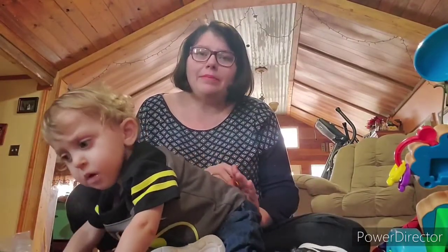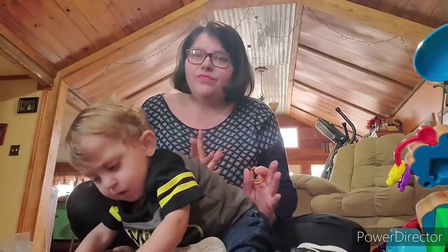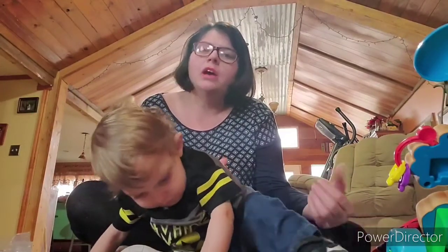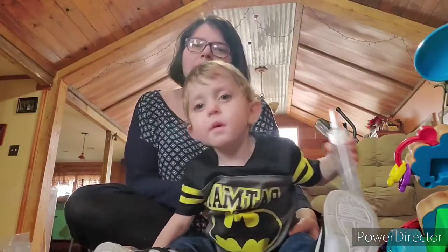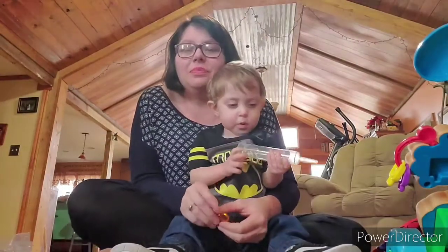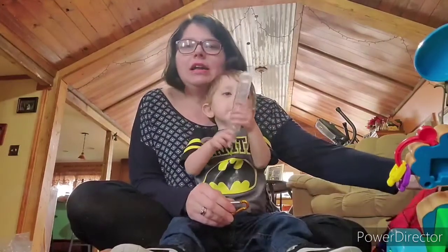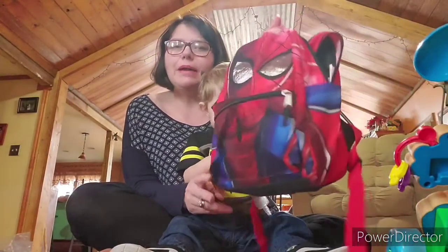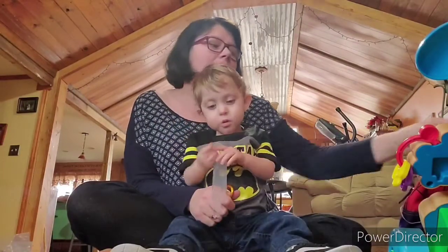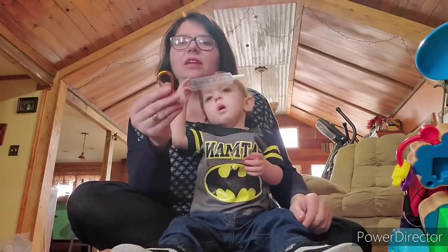One of the things is he has his own little backpack that has his pump inside of it. They have backpacks for feeding tubes that are designed for feeding tubes. We actually had one at one point, but it ended up breaking after we used it for a long time. So I decided to order another one, but they were a little expensive, so I actually just ended up making one on my own. I got a regular size backpack — it's actually just like a little pre-K beginner backpack. And then on the inside of the backpack, I sewed a little piece of fabric about that big in a loop, and then I ended up putting this clip on it.